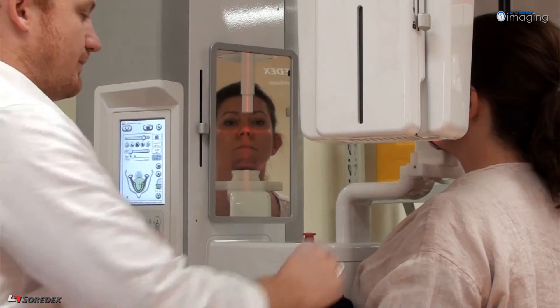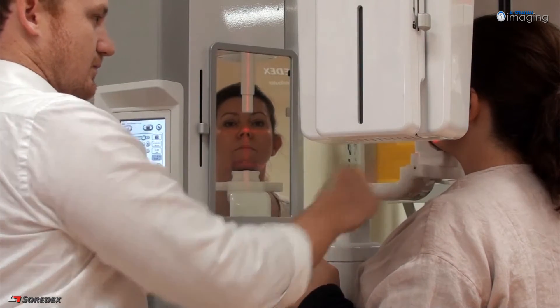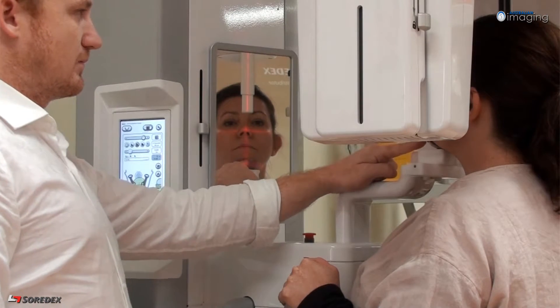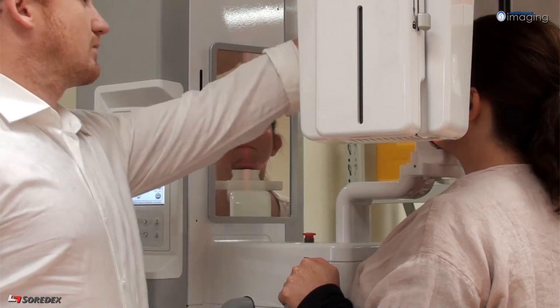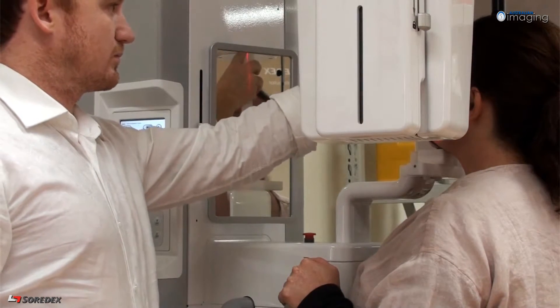Next, check the centrality of the beam by ensuring the mid-sagittal light aligns with the mid-sagittal plane of the patient. Bring the headrest into position and close the temple supports. Once you are happy with your patient position, you are ready to take your scout image.